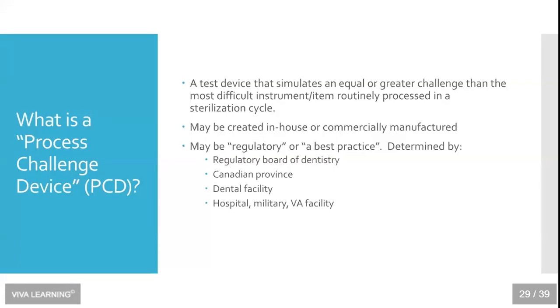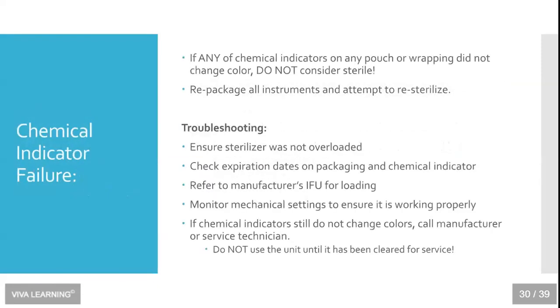In private practice, this is not required at this time, but it is a best practice, and I would ask all of you to consider using a process challenge device to prevent the scenario that I just explained to you above.